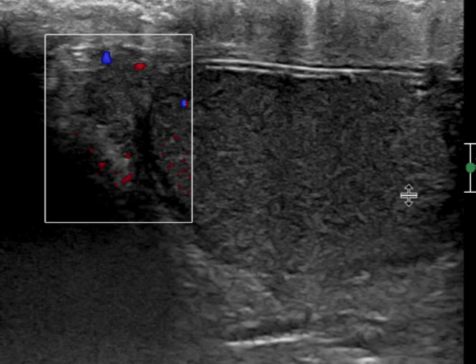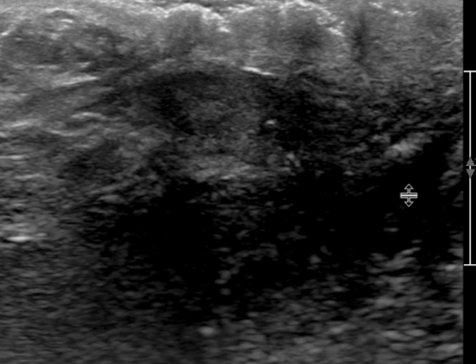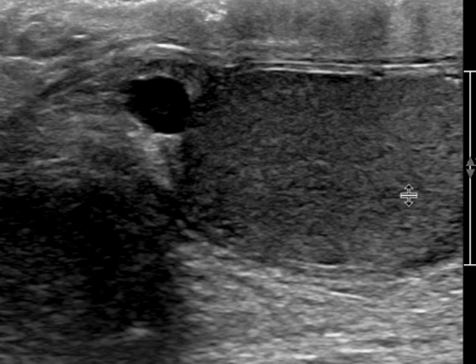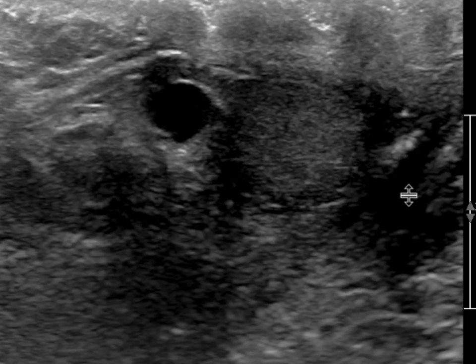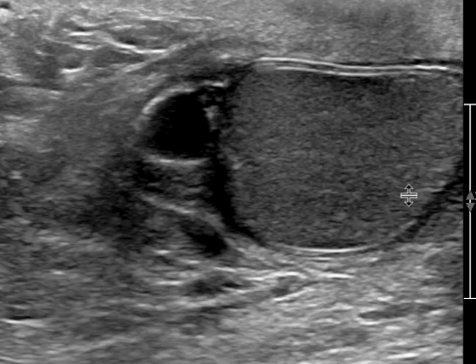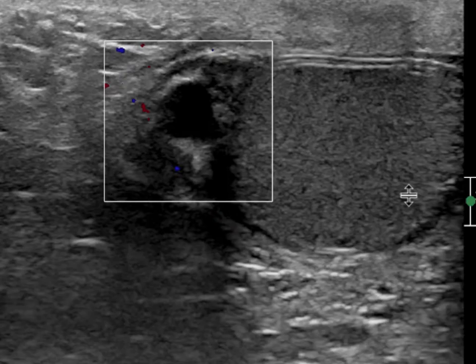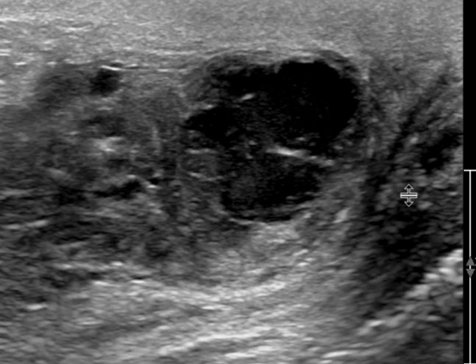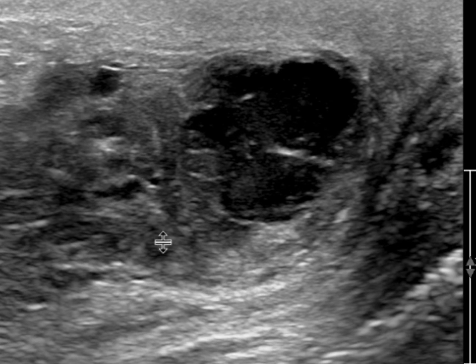The head of the epididymis looks within normal limits, and there's a little cyst or spermatocele there. As we get to the body and particularly the tail of the epididymis, we're starting to see that it's very thickened and very heterogeneous.